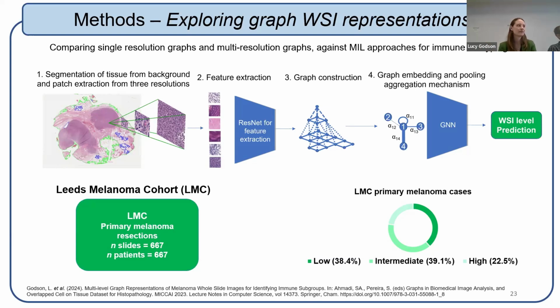Okay. Just wanted to ask, when you said you were using multiple instance learning or aggregation, did you do it for getting a slide level representation from the graph, or was it just for predictions? Just for predictions, yeah. That would be something to try as well, I think.